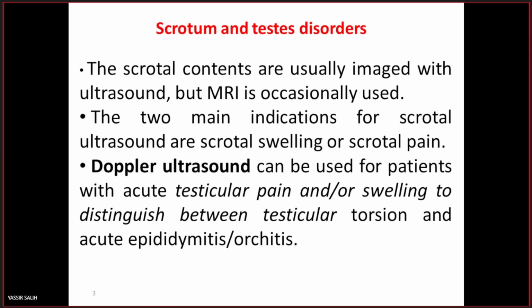So Doppler ultrasound can be used in a patient presenting with scrotal pain or scrotal swelling, because this may be due to a very dangerous and very risky condition, which is testicular torsion.